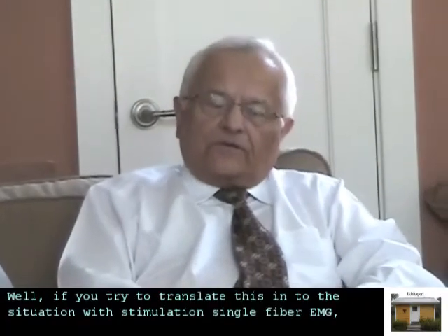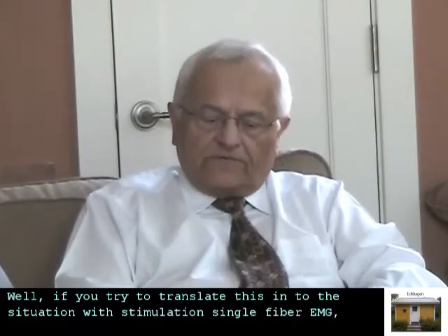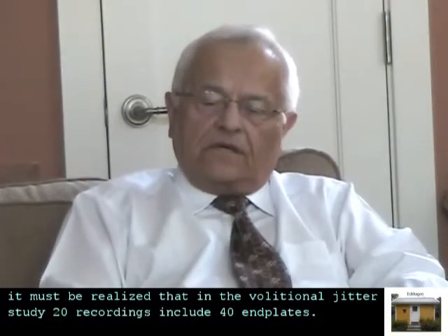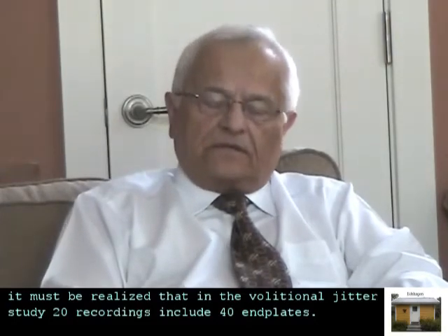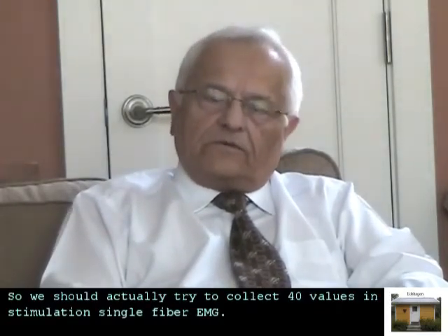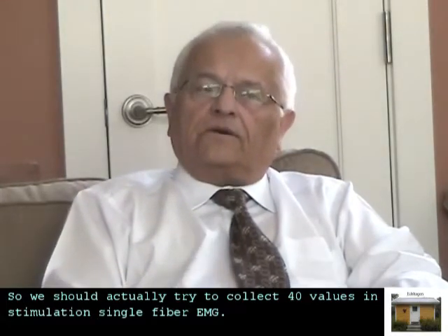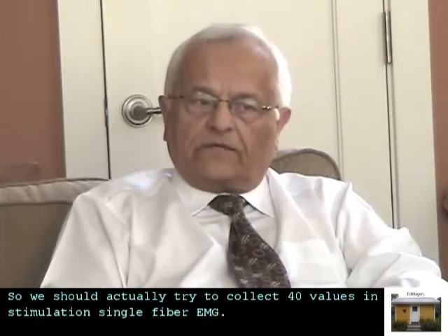Well, if we try to translate this into the situation with stimulation single fiber EMG, it must be realized that in the volitional jitter study, 20 recordings include 40 end plates. So we should actually try to collect 40 values in stimulation single fiber EMG.